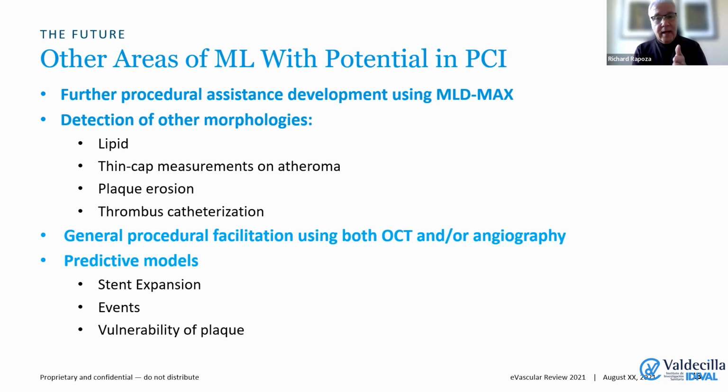Something that needs a stronger stent, for example, if there's a product out there that says this stent is a lot stronger and it will work for this lesion, not the workhorse with direct stenting, that's a possibility. And then all other lesions that will show less than X% probability of expanding with any stent, those will require prepping.